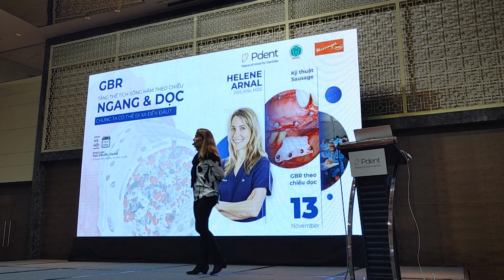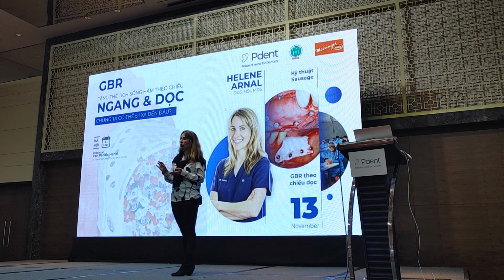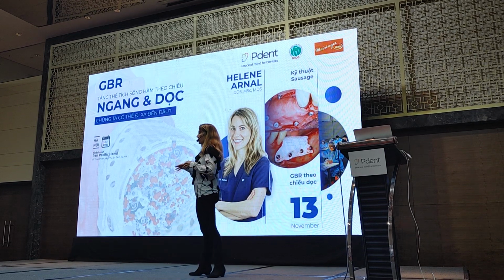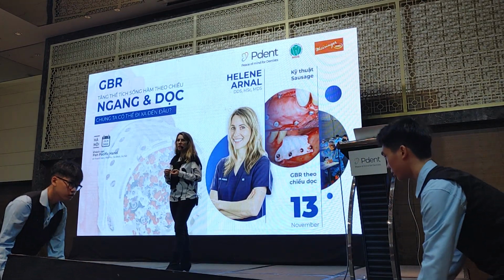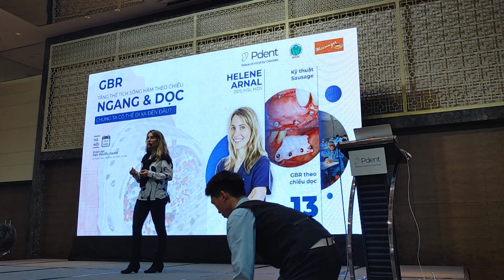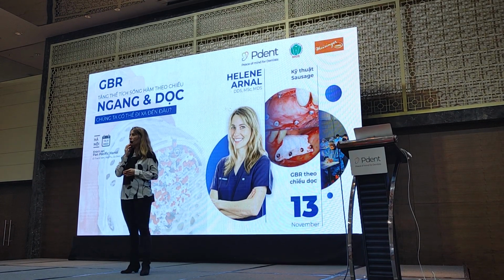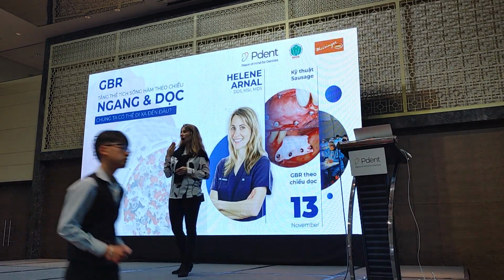Normally, if you do the harvesting thin enough, you do nothing because you will harvest just 1 millimeter thickness. So there's nothing to do. If it's your first strip harvesting, potentially you can have too thick a strip. So you will have a big hole in the palate, for example. On the buccal, that will never happen because the gingiva is too thick.